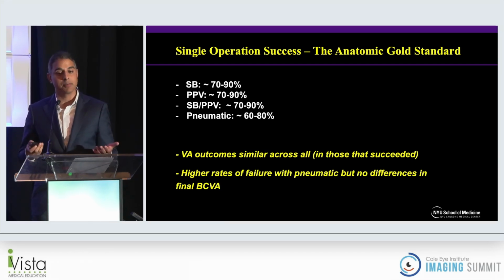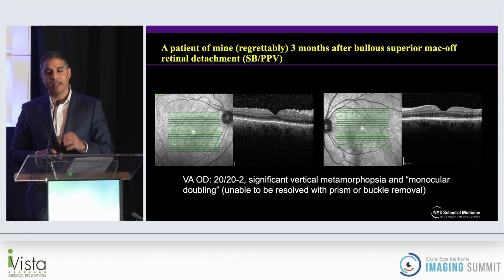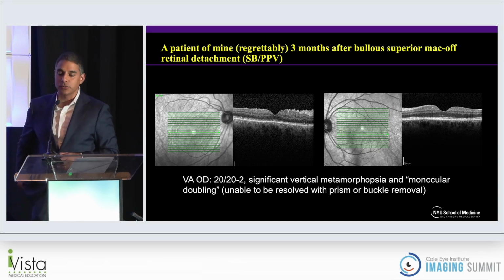The success rate is similar. Pneumatics is obviously a little bit lower, but there's no difference really in final best corrected visual acuity. And so this is a patient of mine that, regrettably, I would say, sort of changed the way that I think about retinal detachments.